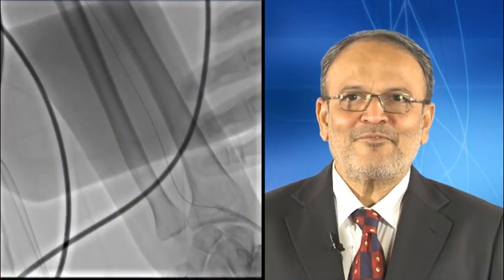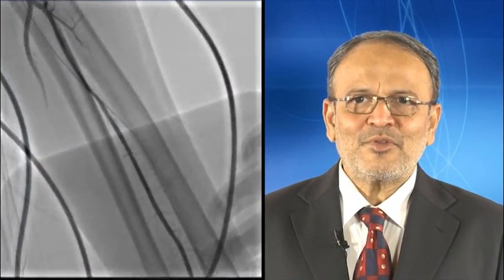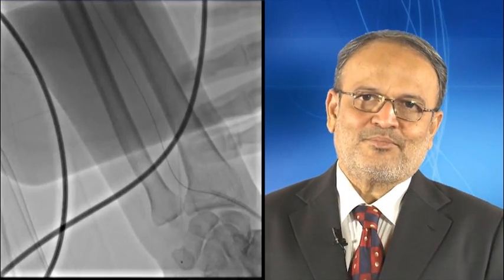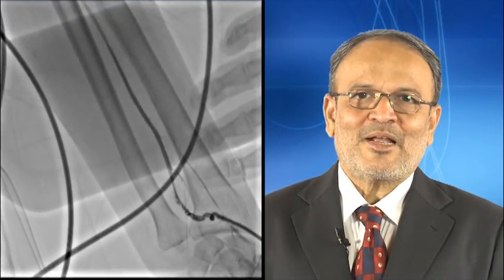While negotiating the introducer sheath, the patient complained of significant pain and discomfort, and we removed the dilator to inject the contrast to understand the problem. To our surprise, we could see a very low 360-degree loop in the course of radial artery, which did not allow the introducer to enter. However, the radial artery segment beyond the loop was quite normal.